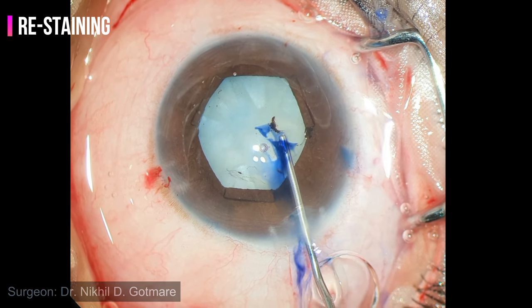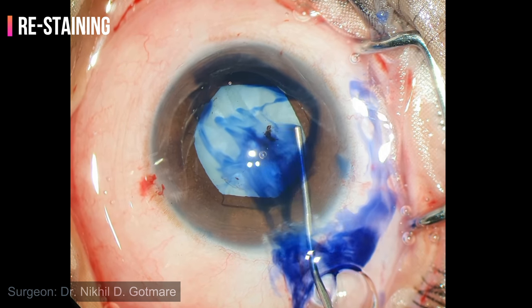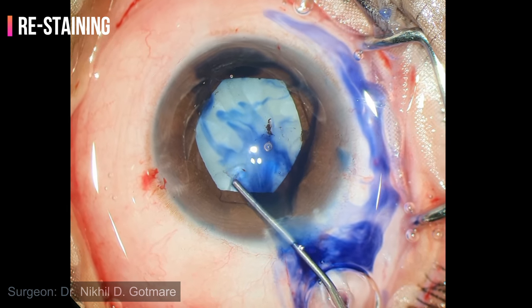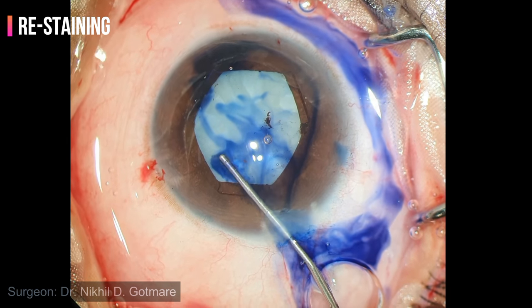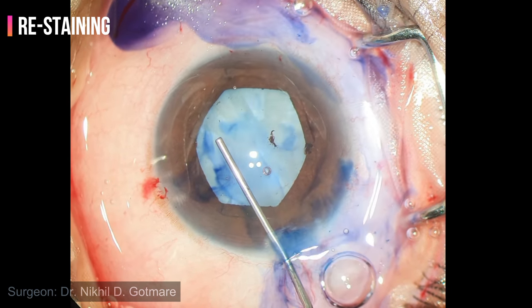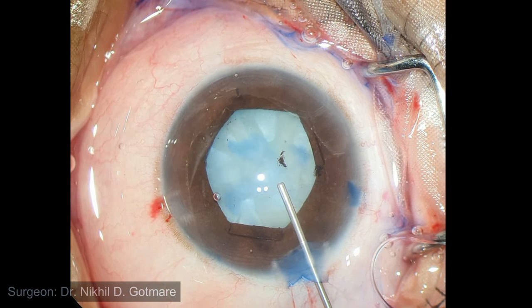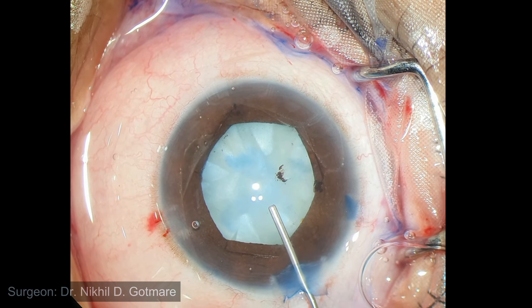Now trypan blue dye is painted over the anterior capsule to achieve staining of the remaining area. Excess dye is washed out. More cohesive viscoelastic is injected to counter the intumescence of the lens and also to achieve further viscomydriasis.